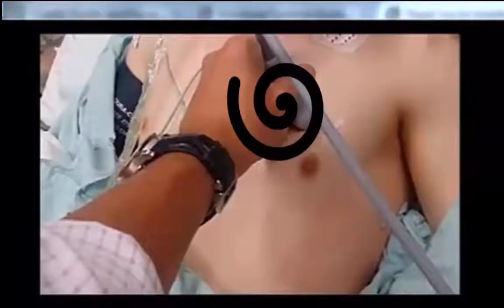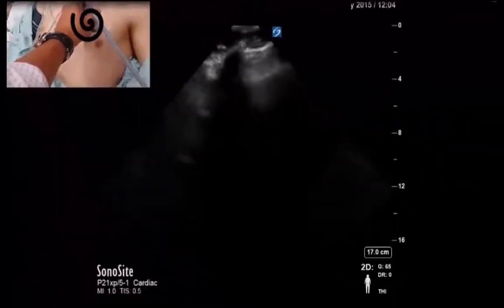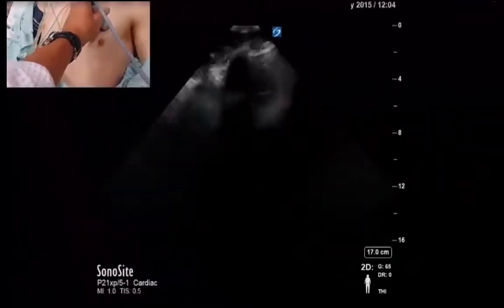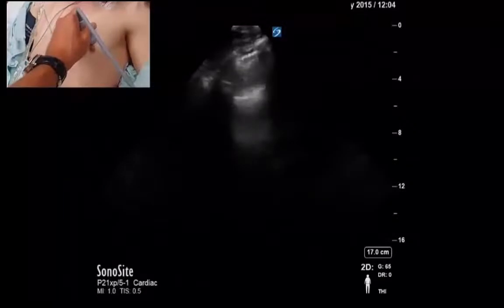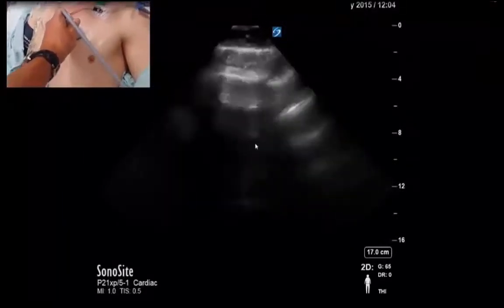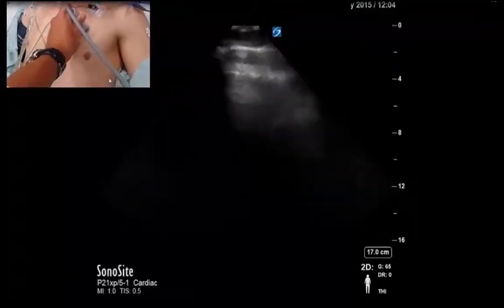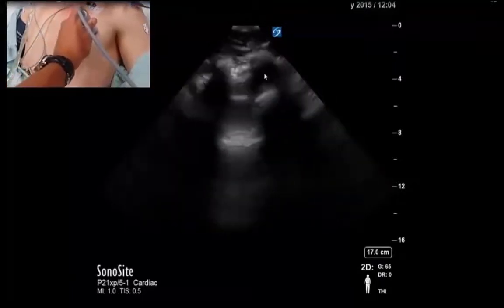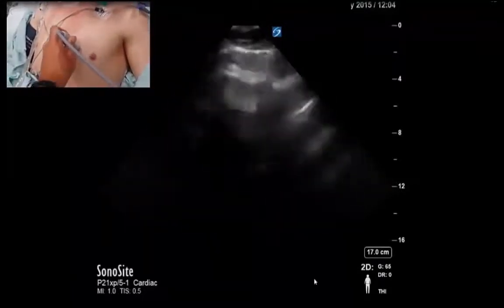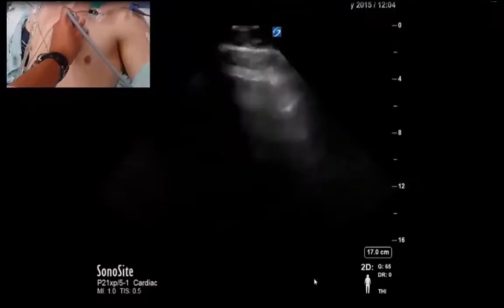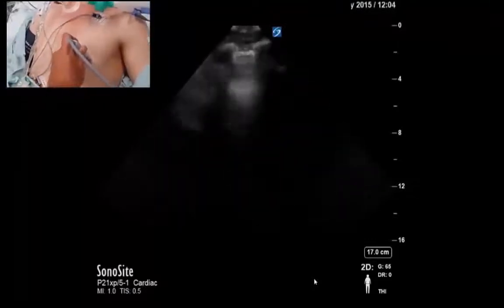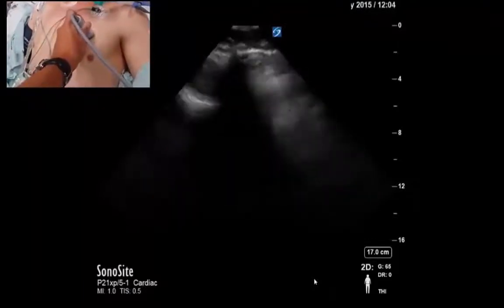I see no acoustic window. I'm moving around in a circular fashion, all the while looking at the screen. I've now cleared the entire anterior chest, and at no point on the screen do I see anything other than dense lung artifact and rib shadow. This is a highly efficient and unfortunately non-reassuring maneuver for the parasternal space.